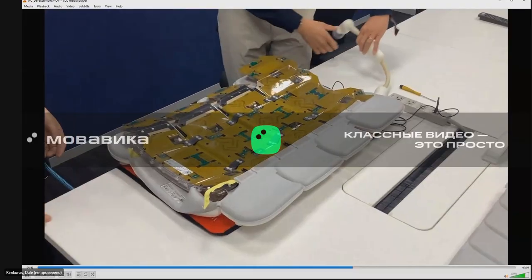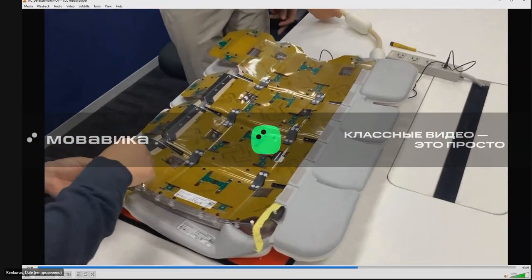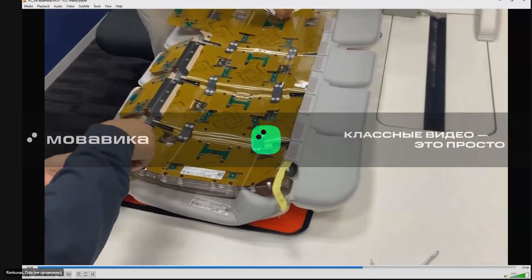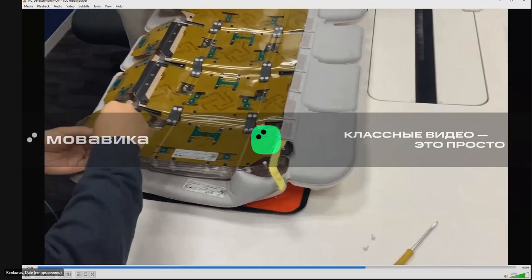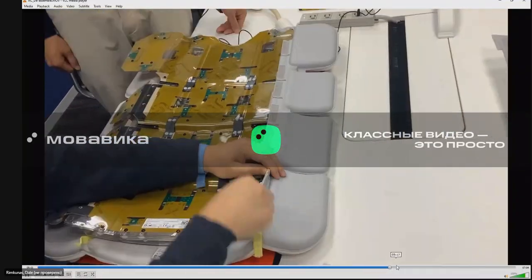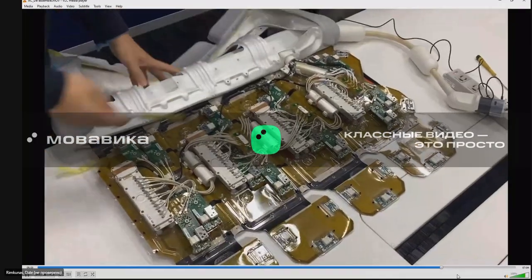Just like this. So I know this looks crazy, but the anterior coil is our number one replaced coil in the field. To make it simple, you have to remove the pin just like this. This is why this is being pursued. Fast forward a little bit. All the way, and now you see your coil.